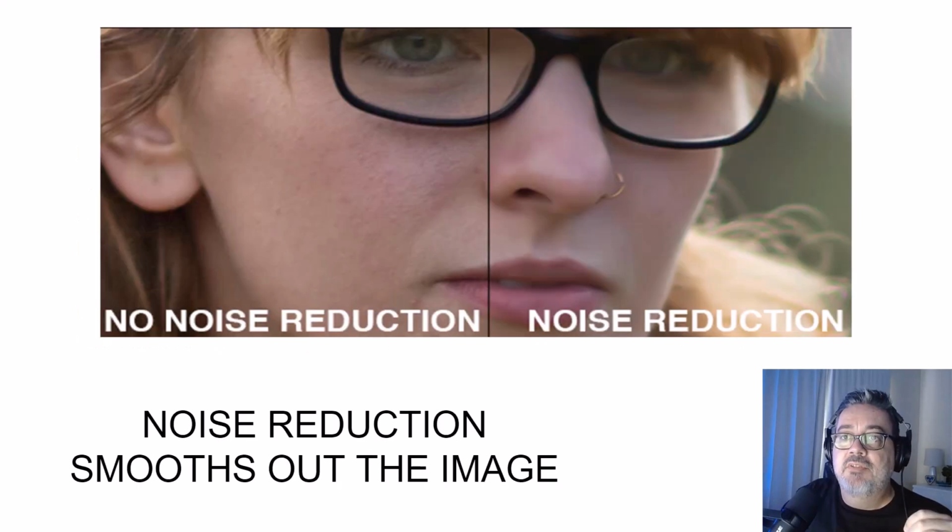Here's a good example of an image with no noise reduction versus a noise reduction filter. If you've spent any time on Instagram, you'll be familiar with some of the filtering options available that'll take 20 years off your selfies. It's the same process being applied to radiographs for specific situations.